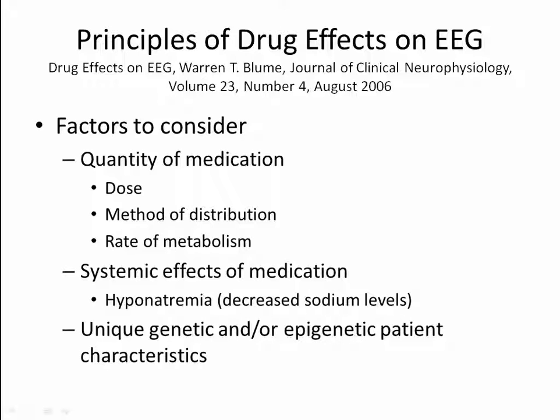This is particularly true when we're looking at a database comparison, because if we're looking at certain medication effects, it may cause one or another EEG frequency band to show as excessive or deficient. It might affect phase relationships, it might affect coherence, and so it's important to understand, at least to some degree, what effect these medications might have.